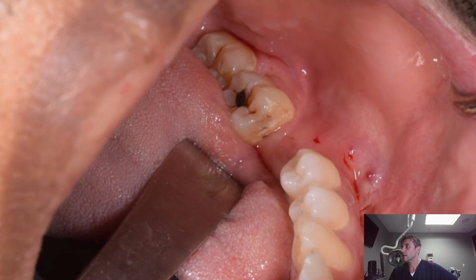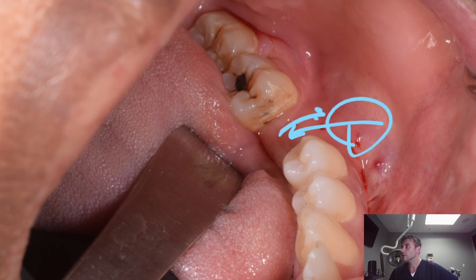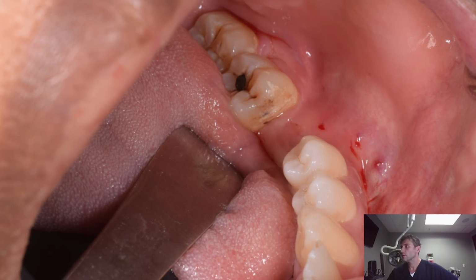This is at the time of the second surgery when we were placing the implant. As you can see, we did pull some of the cheek this way, and it closed it over. But a lot of times when we uncover this implant, we pull this back, and so you don't have this tension here. So that's not a big deal. And as you can tell, it looked initially really, really swollen after surgery, but it looks pretty good now. There's not much swelling there. That's pretty typical, especially if you give it a long healing time, 6 months later.